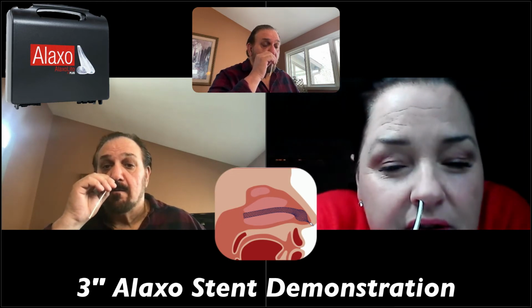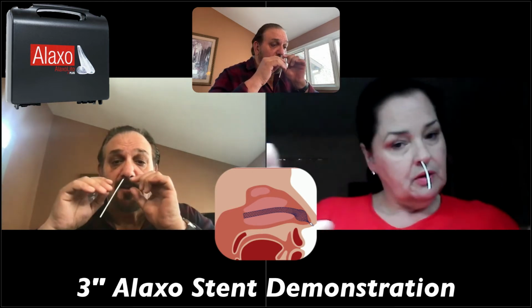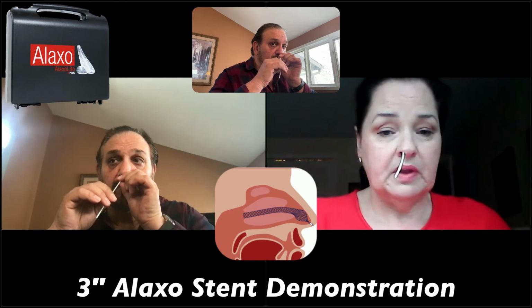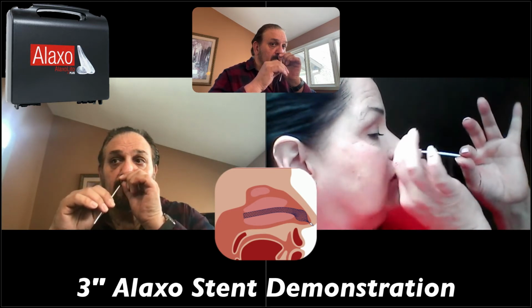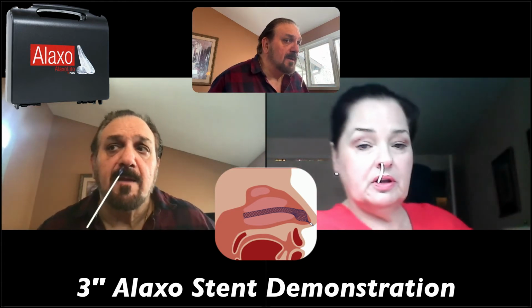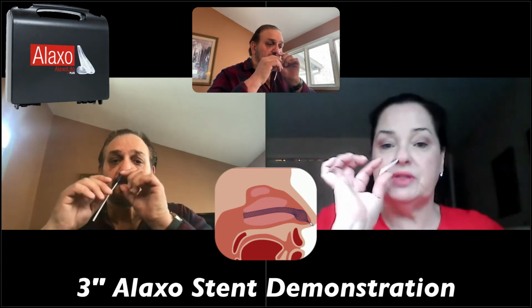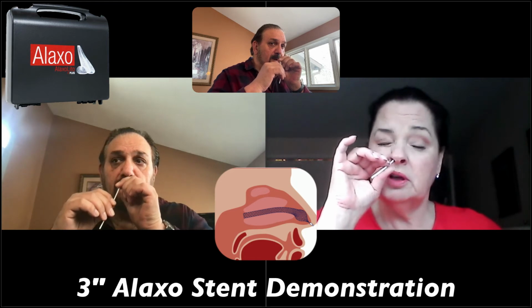Sorry, sir? I don't think I can slide it back in because then the tube would have expanded it. Yeah, don't slide it back in. Never push it back in. So you just hold on to the white a little bit and start pulling this tube off until you can pull it all the way off. So I think I pulled it out too far, right? Yeah, you pulled the whole thing out with the stick, which is fine. That's no big deal. Just pull it all out now. Pull it all out?